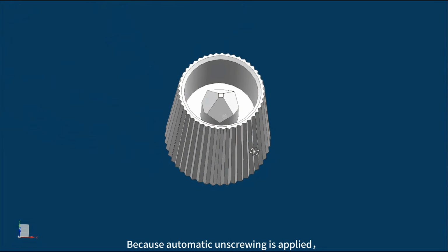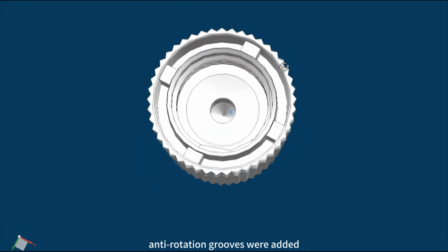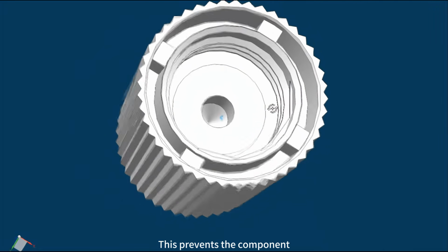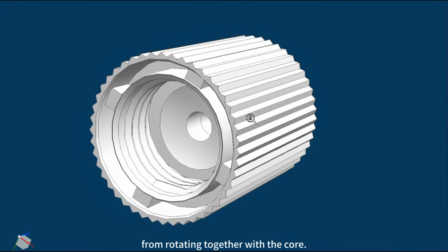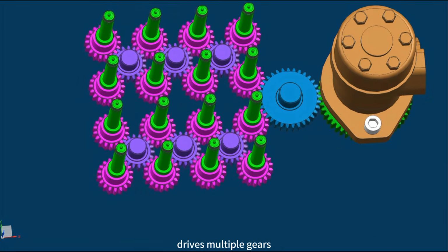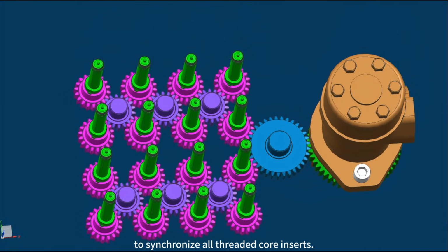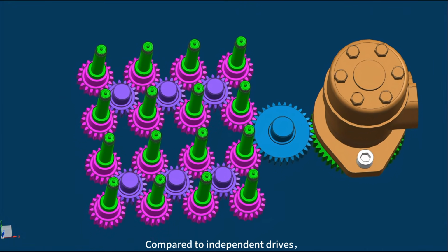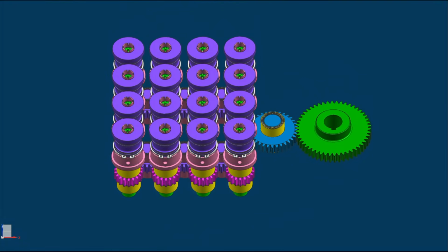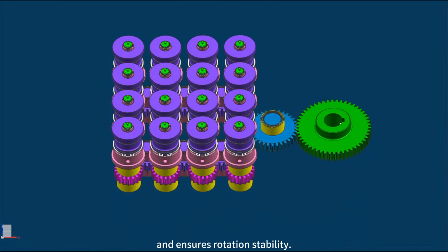Because automatic unscrewing is applied, anti-rotation grooves were added at the bottom of the part. This prevents the component from rotating together with the core. A single hydraulic motor drives multiple gears to synchronize all threaded core inserts. Compared to independent drives, this structure reduces cost, simplifies maintenance, and ensures rotation stability.